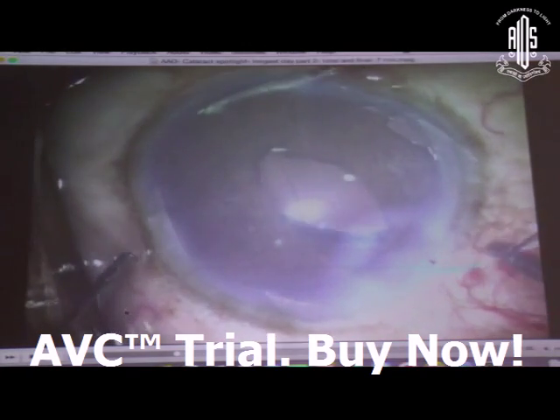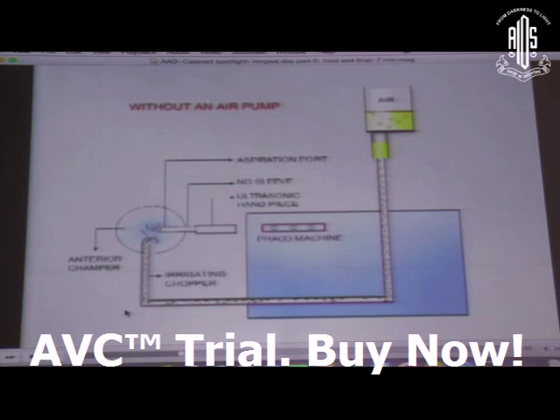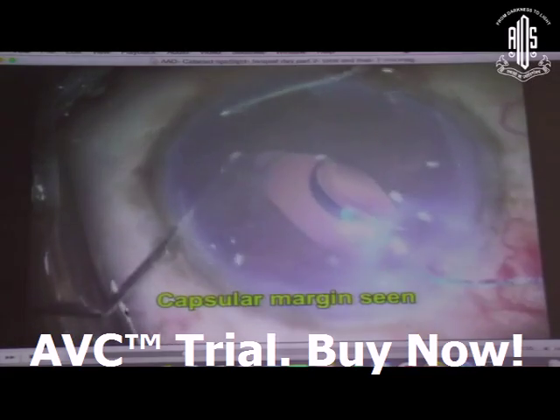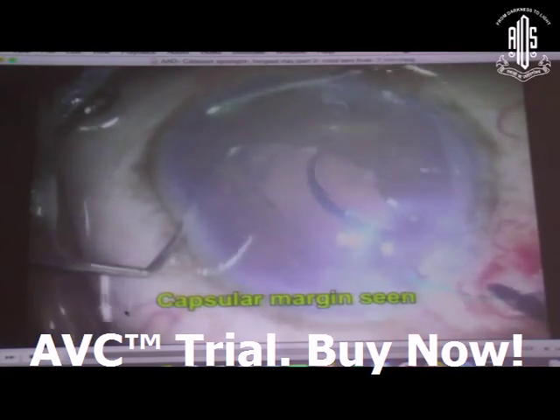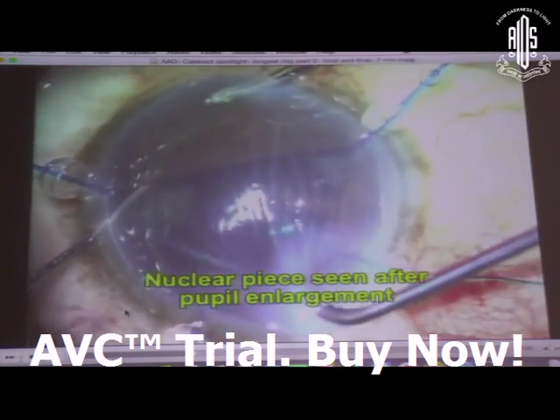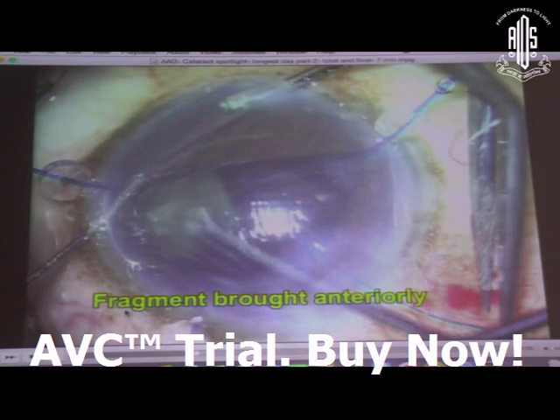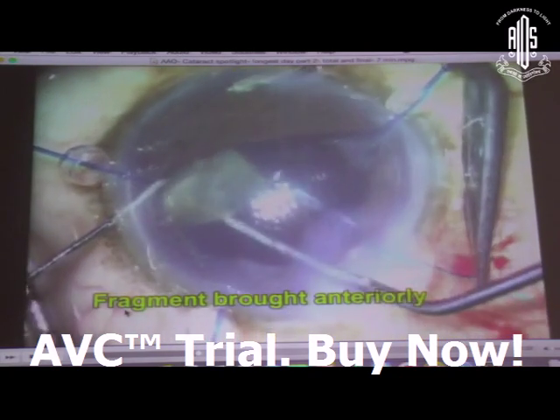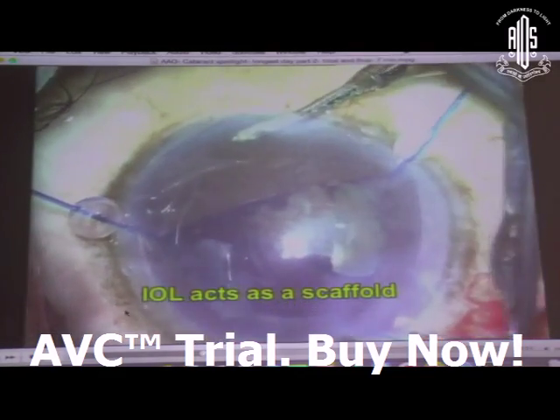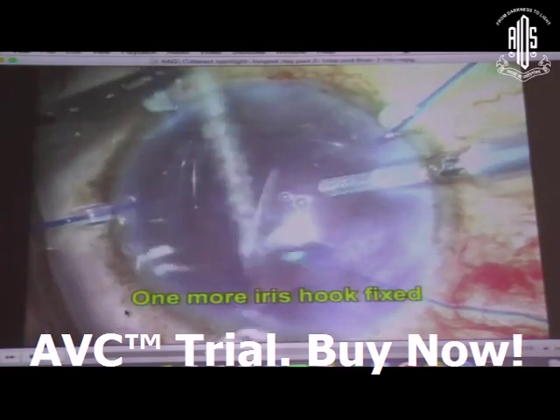You watch carefully, I also installed an AC maintainer. Today we have a Procar AC maintainer, but at that time we were using AC maintainers to have fluid in the eye. Now when the pupil was still small in this particular case, I decided to go ahead with iris hooks. And you can see behind a small fragment still lying there. So what I thought was, I'll just bring it out, put it above the IOL, and now emulsify this fragment, and again using it as a scaffold, finished it.